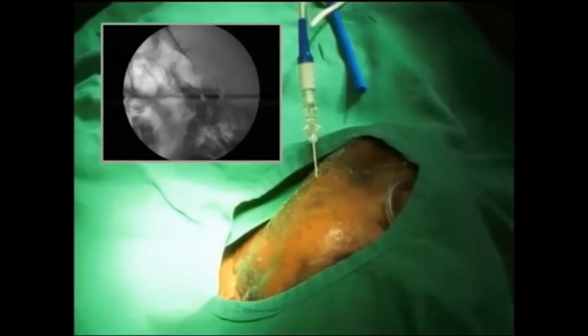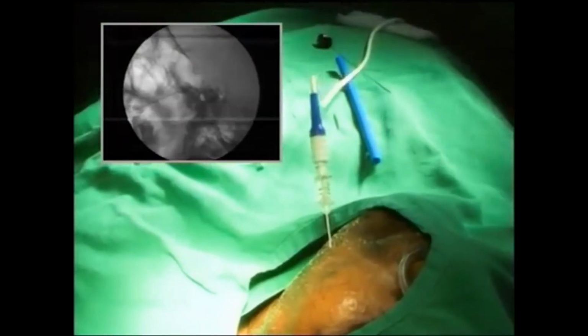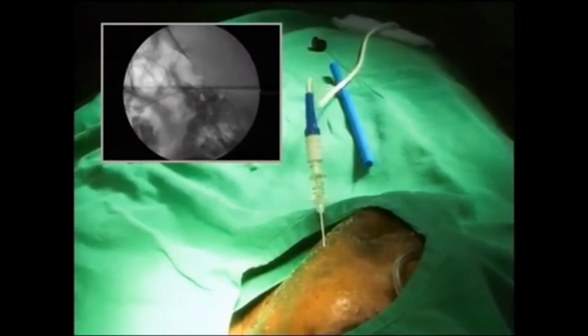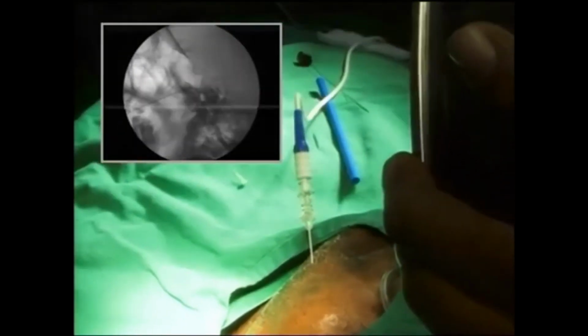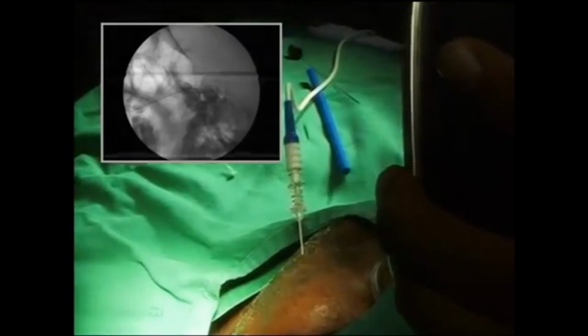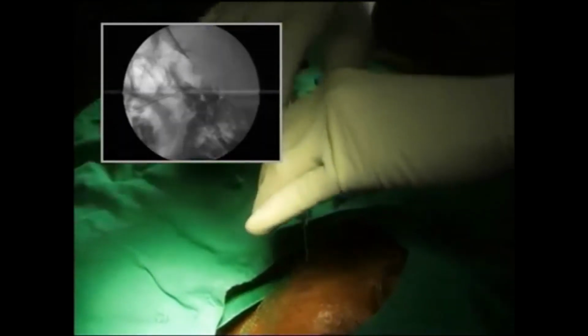Okay, so you see that I'm getting beautiful masseter contraction, which I don't want at this stage. So I probably will have to go. I'm getting beautiful masseter contraction at 0.5. Can you reduce it? Can you appreciate the masseter contraction? So I don't want that, unfortunately, in this case. So probably I'll have to go a little bit more deep.